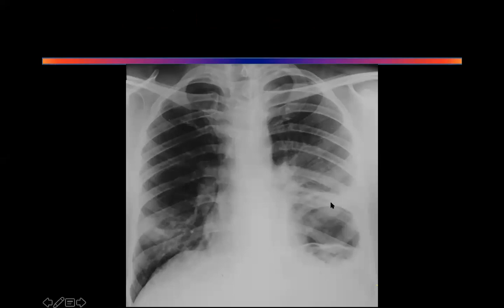Okay. So we cannot comment on the diaphragm in this. Can you comment on the diaphragm? I cannot. Where is the diaphragm? Can you say where the diaphragm is? No, I have no idea where the diaphragm is. Okay, so don't talk about those things. Talk about the one thing which is staring in your face, the cyst.